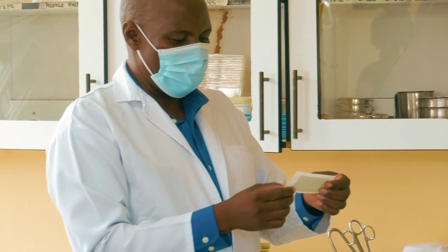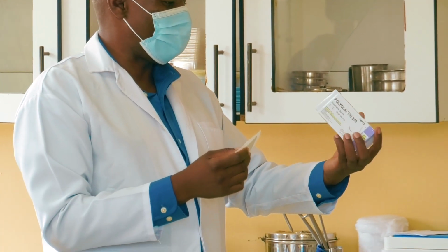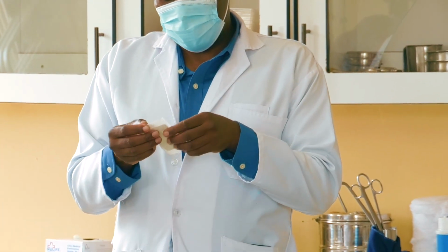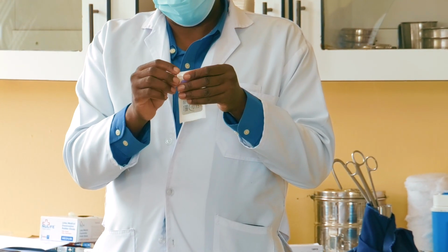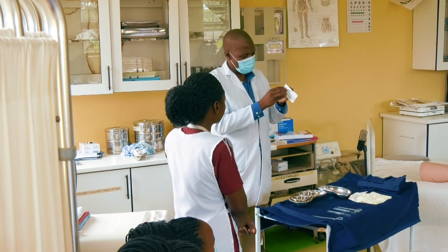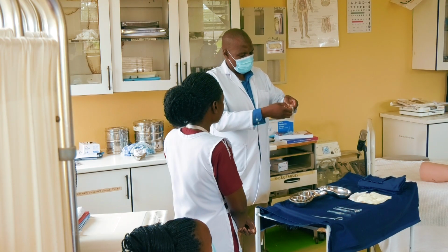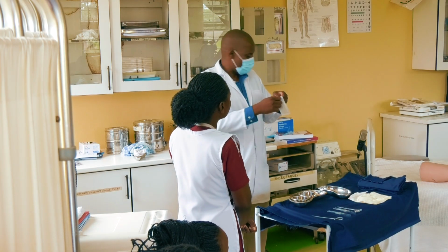Even this suture, you have to say, okay, from the box, it's still sterile, I can use this suture, so that you don't use expired sutures. The way some gloves are, most sutures are that way, you don't tear, you have to go this side. There should be a part that you should be able to open. Now, our sutures, we need to check our expiry date. Okay, it's good here. So, the way you open, you just go. Okay, let me demonstrate.